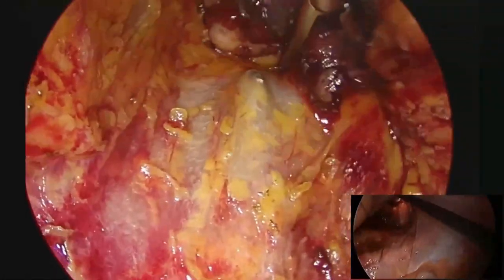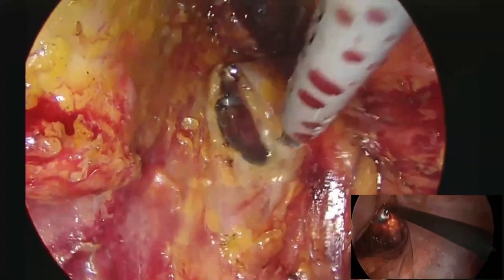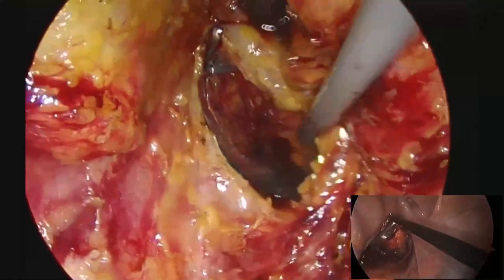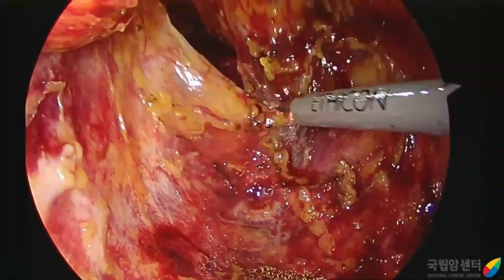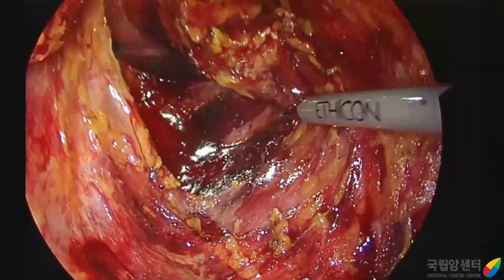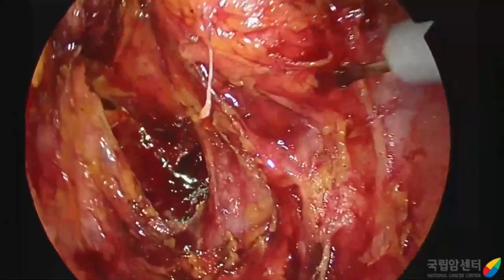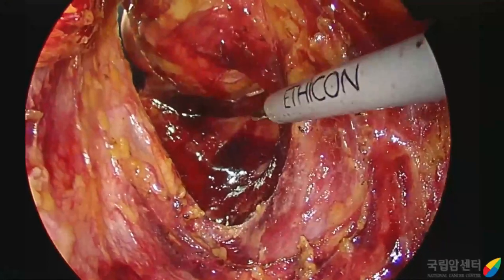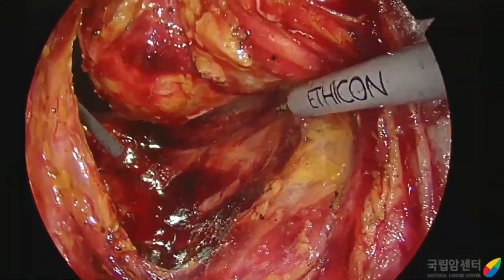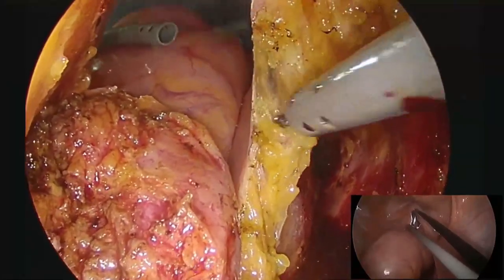We can easily communicate with the posterior dissection plane. Tissue exposure during dissection is better achieved by pushing the specimen into the abdominal cavity. Because we have done circumferential dissection, it is easy to remove the remnant tissue and attachments around the rectum.